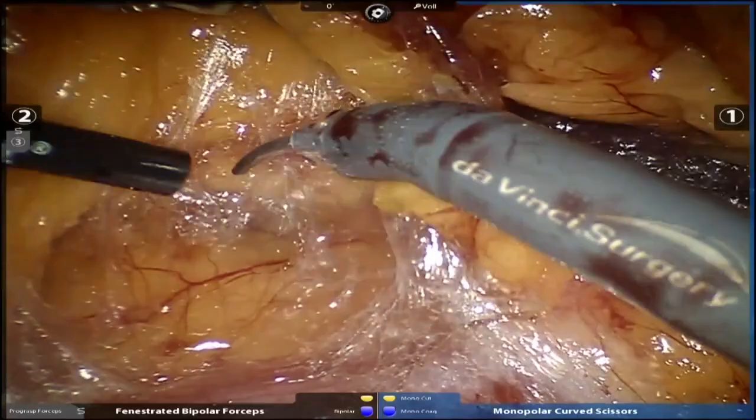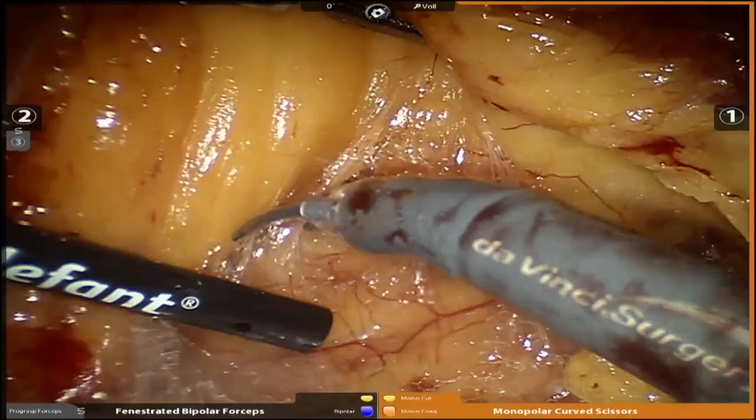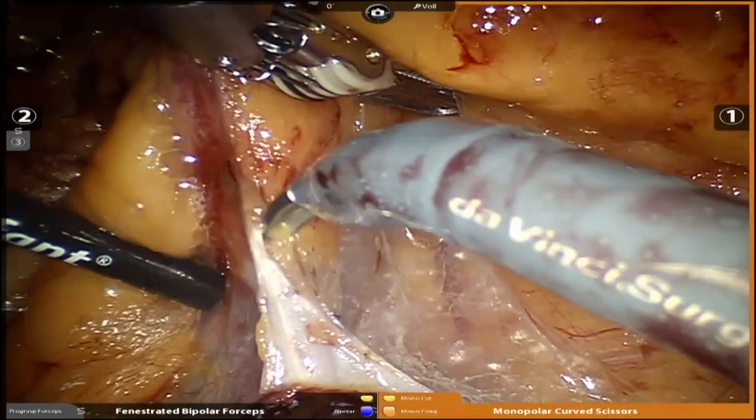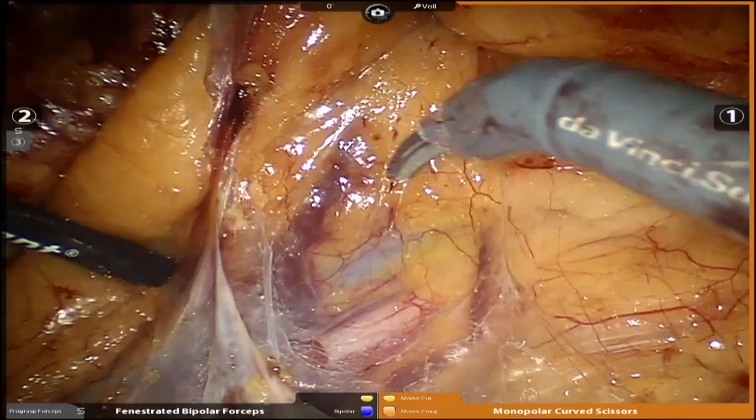Have you seen the ureter already? We're inside Gerota's fascia now, and I'm walking towards the hilum. So I'm working down now towards the ureter. Brandon, come off, please. Brandon, come off. So there's gonadal, there's ureter, there's gonadal. Yeah, that's very nice to see these good structures. We're in the lower retroperitoneum, and now I'm going to go towards the hilum.